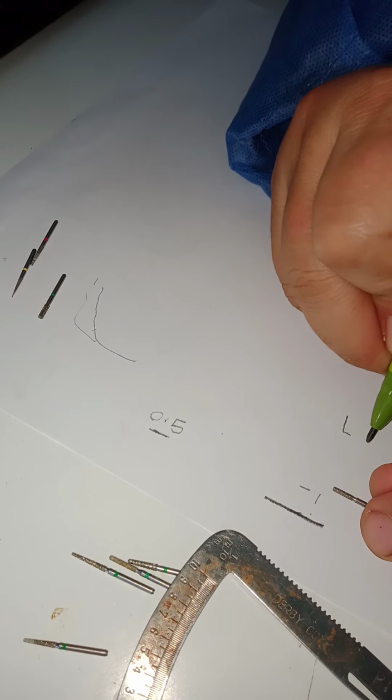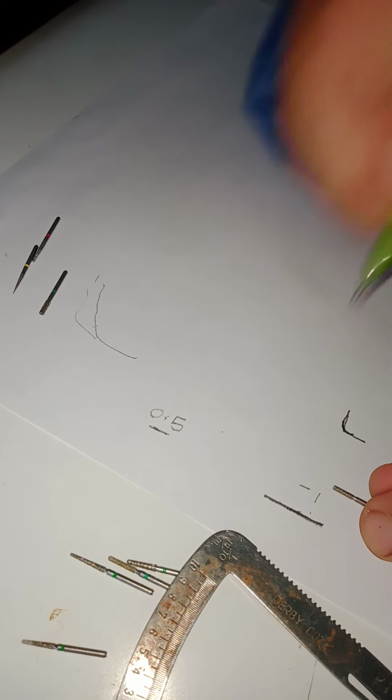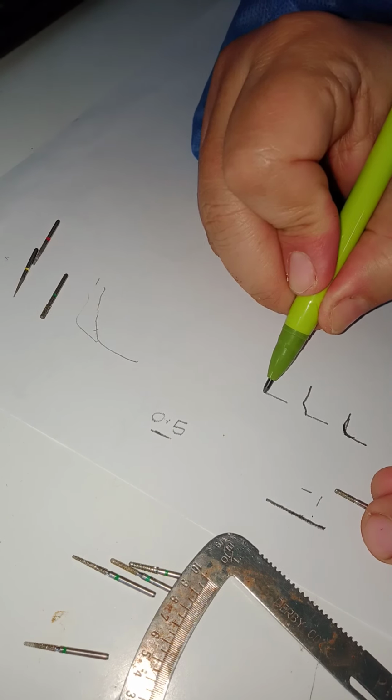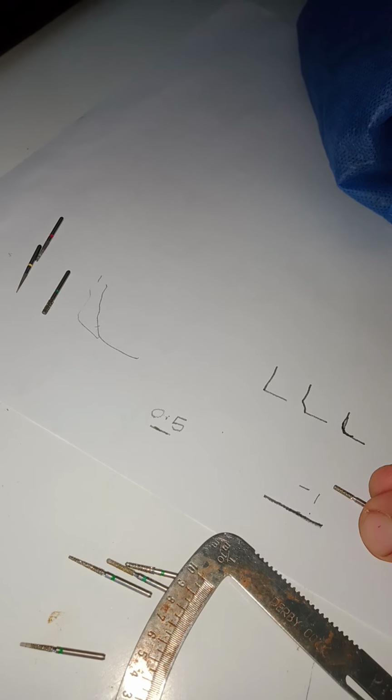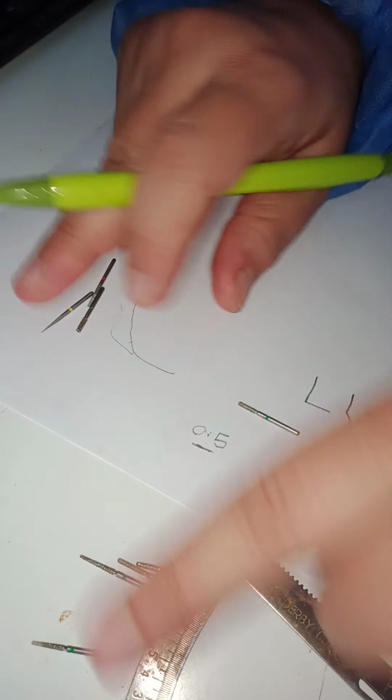If you want this morphology at the angle, use the rounded end tip. If you want this morphology, use the chamfer. If you want this morphology, use the shoulder end bur. The 0.5, I could use once more all of these burs.